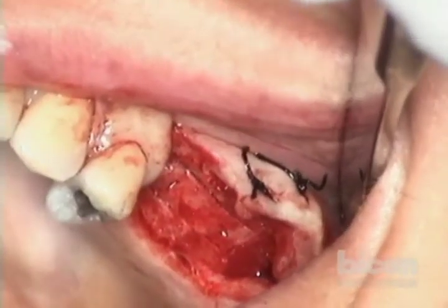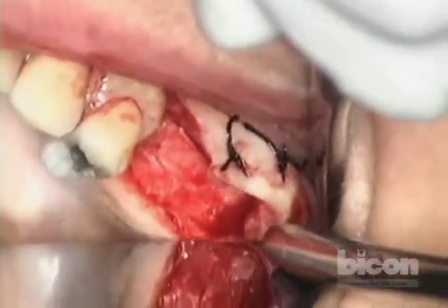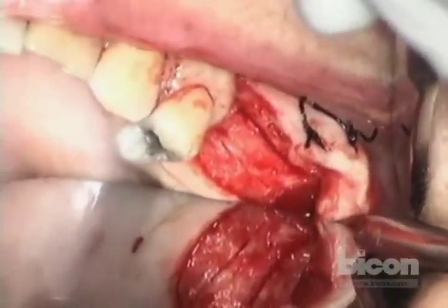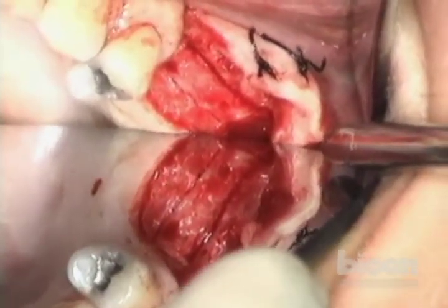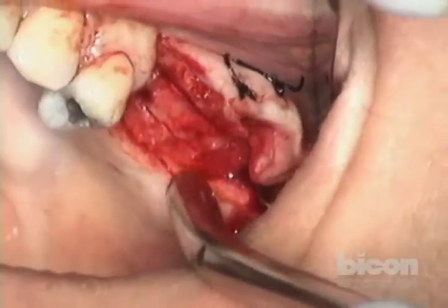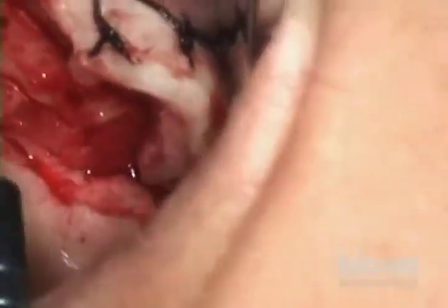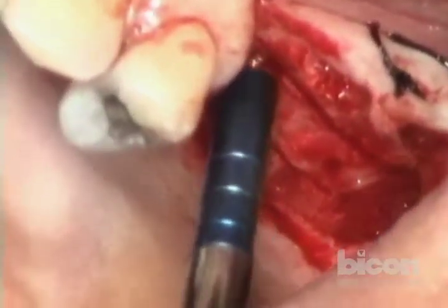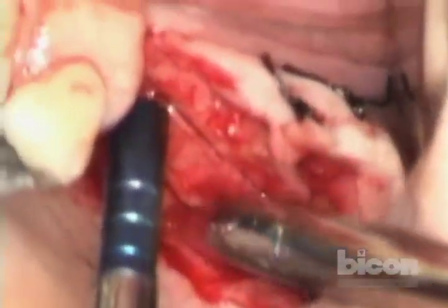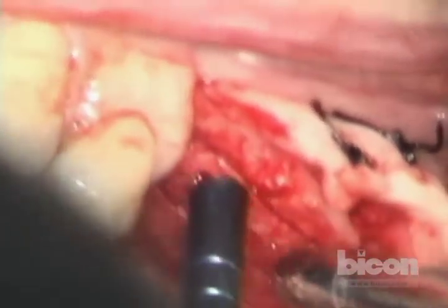Let's show you the rectangle — we can see that beautifully. The first area where you want to concentrate is the area that's hardest to fracture — which would be the mesial one. So we start there and just tap on it. The idea is you're going to mobilize it slowly. If it doesn't move, you can feel the resonance of it.